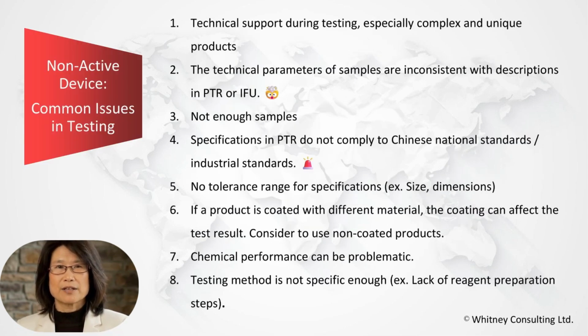When testing non-active device, again, I have to mention the importance of having technical support nearby, and prepare sufficient samples and comply to Chinese testing standards, of course. Please define the tolerance for the specifications, the plus and minus percentage if possible, and be aware that the coating on your finished product can affect the final result of the testing. And be mindful that chemical testing can be tricky at times, so always specify the testing method in detail, including reagent preparation.